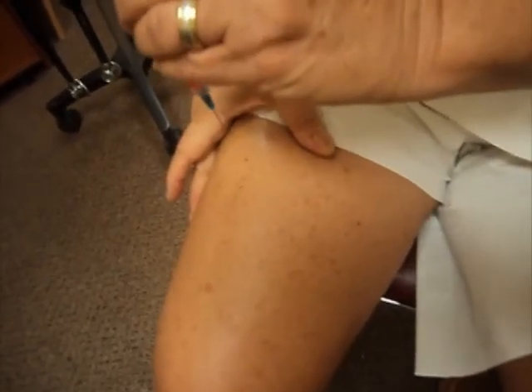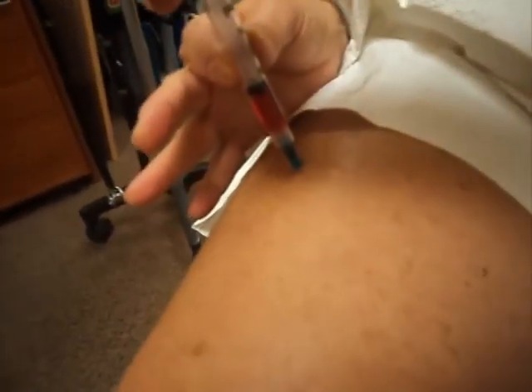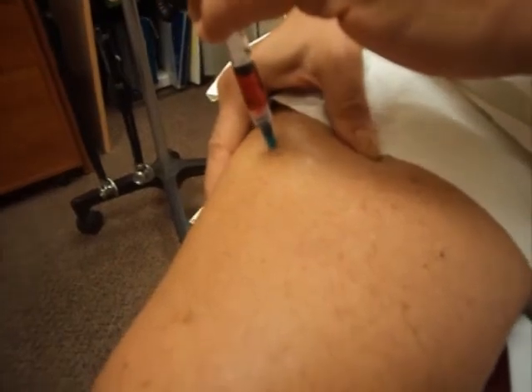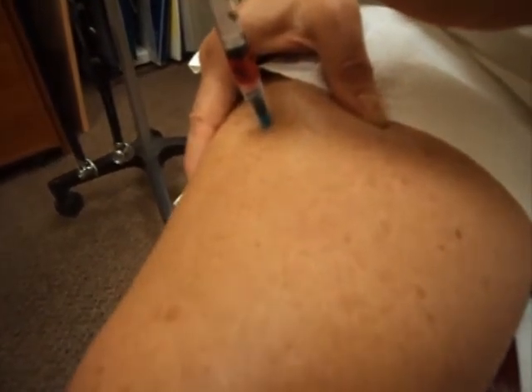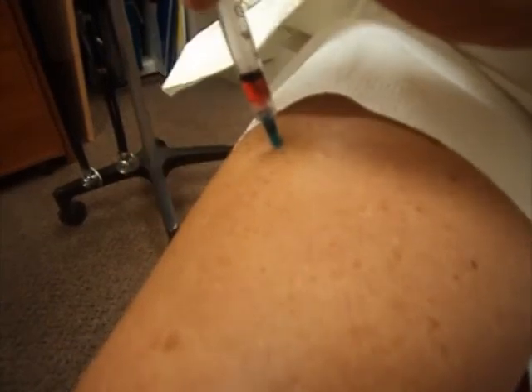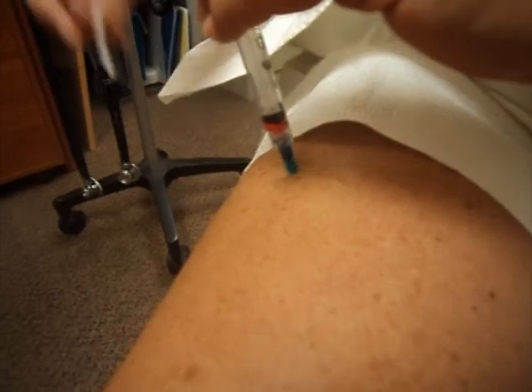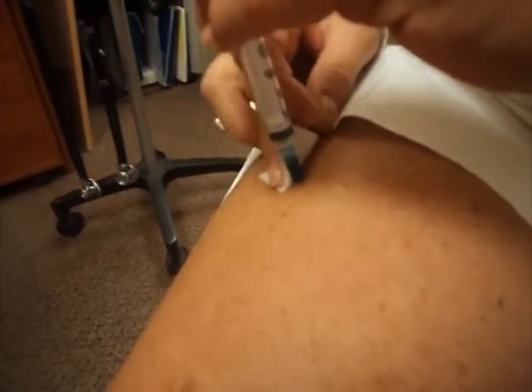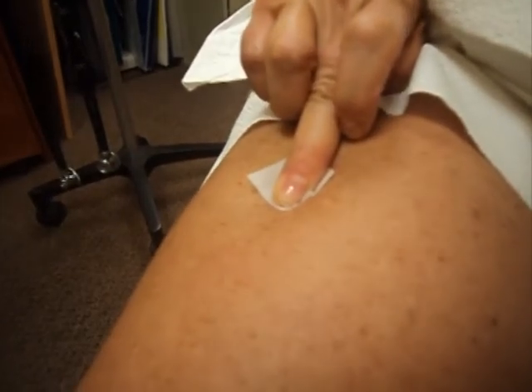We can firm up the skin a little bit. 1, 2, 3. We check for any blood return. There's none. And then we just give it slowly, easily into the muscle. And when you're done, just pull it out and hold some pressure so it doesn't bleed.